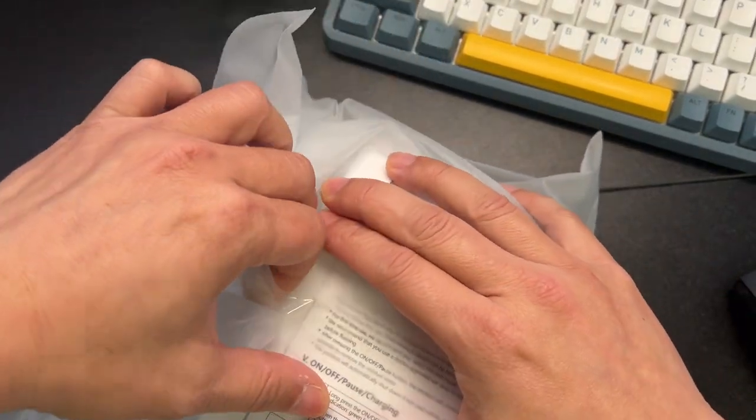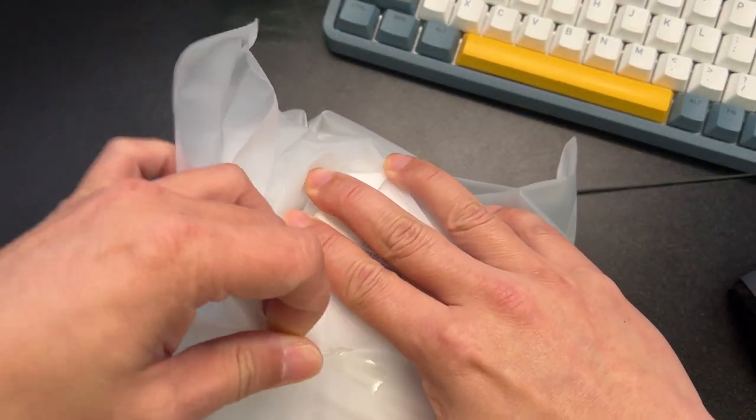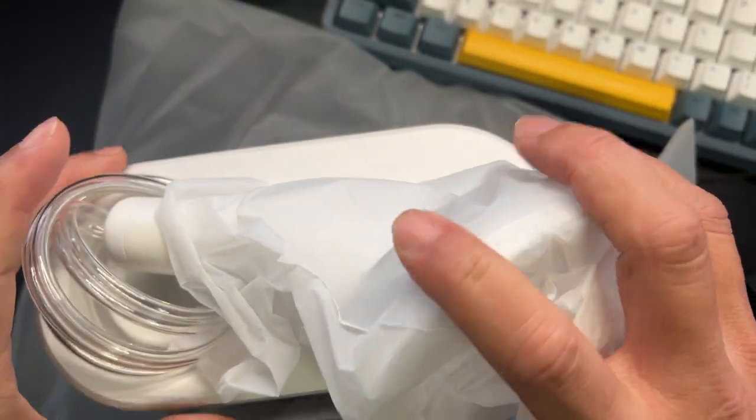Today we're unboxing something kind of cool — this electric ear wax removal kit. I went with this kit because of the way they designed it; it looks really cool.